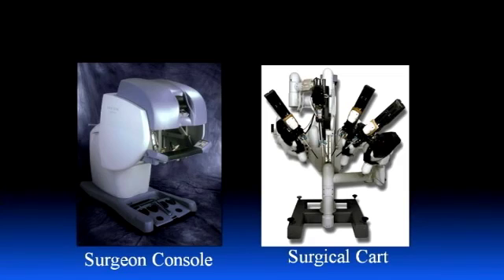This is what one of the newer models actually looks like. This is where the surgeon would sit after the surgeon places these little metal ports in the patient and then snaps on these robotic arms and places the instruments of use for that particular surgery, as well as the camera. So all of this would be inside the patient's body cavity. The surgeon would then take off their sterile gown, take off their sterile gloves, and go and sit here.